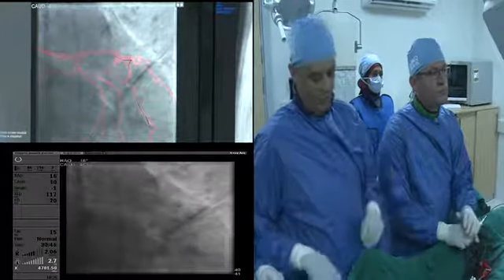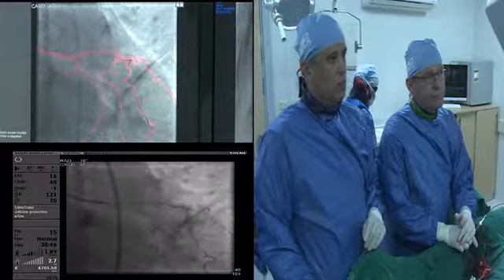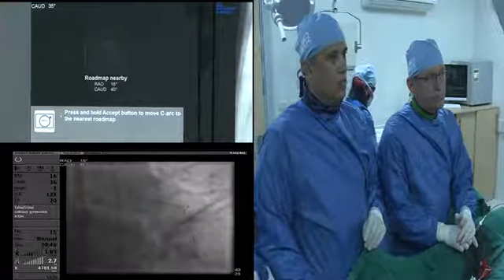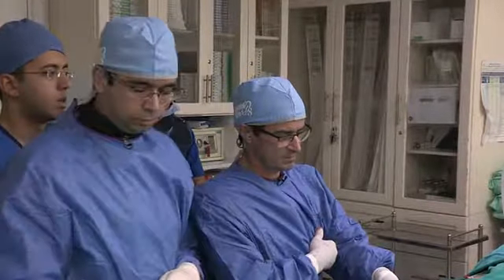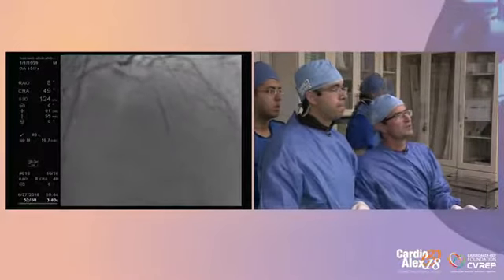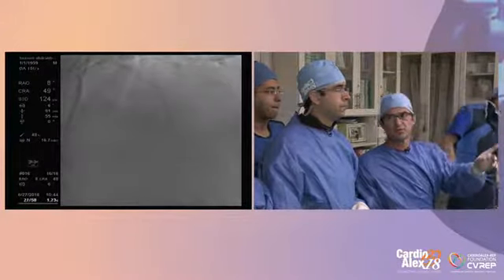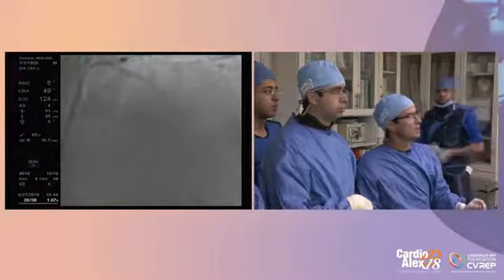Yes. And we'll see the result. Yes, very early. Quick picture. Okay, so in fact, can we show you the angio before?